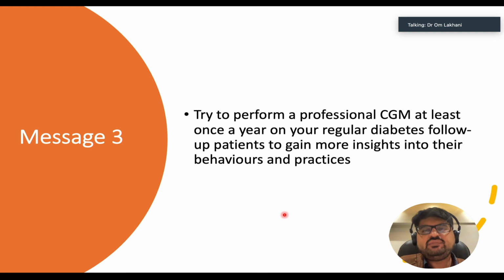Try to perform a professional CGM at least once a year, very similar to what Dr. Unni sir said, on your regular diabetes follow-up patients, to gain more insights into their behavior, into their practice. And most importantly, I'll tell you, it will make you a better clinician. It will make you a better diabetologist or endocrinologist or diabetes educator. It will actually enhance your practice because you learn a lot of patient behaviors from the CGM data.